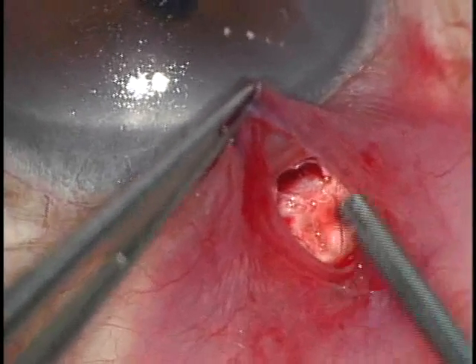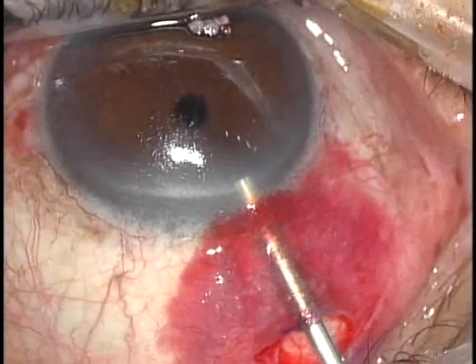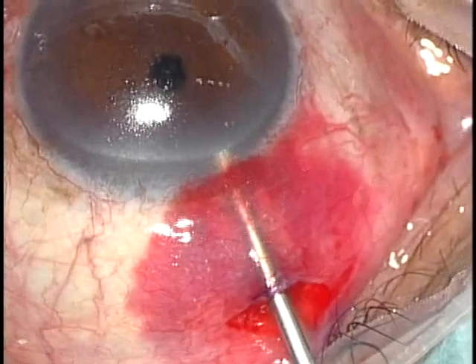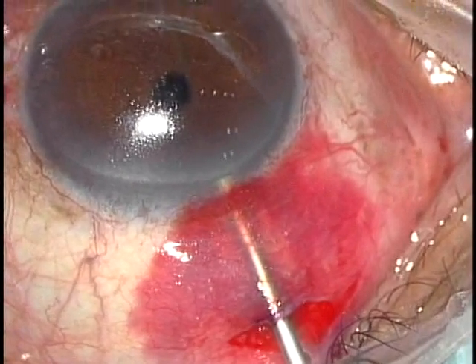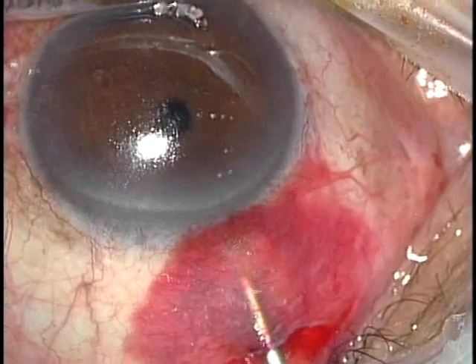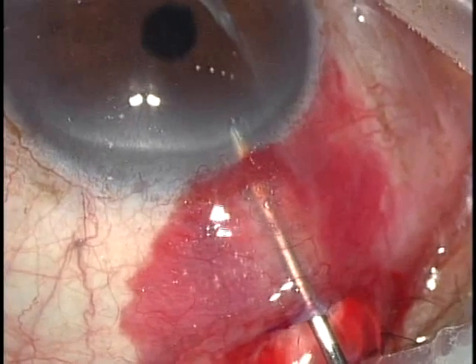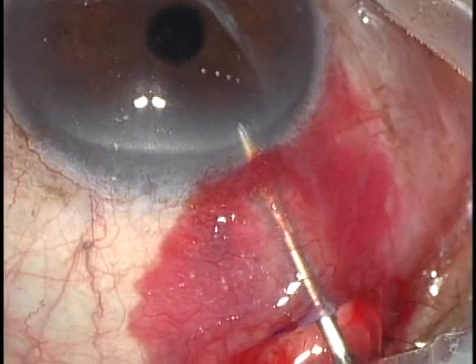The complication rate is much less than both. We use a 20-gauge vitrector to create a peripheral iridectomy, set at a rate of 200 cuts per minute and a vacuum of 200 mmHg. A peripheral iridectomy helps avoid iris incarceration into the internal sclerostomy.